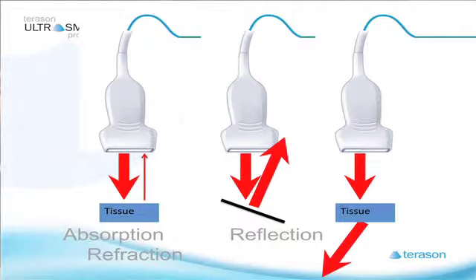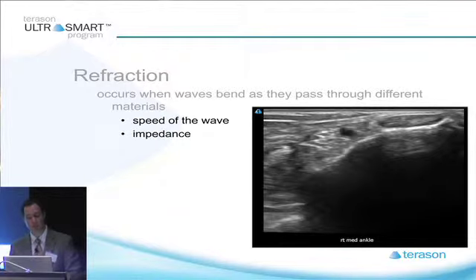For instance, if you're looking at something very dense, let's say a cross-section of a tendon, which is what we're looking at on this side of the screen. Forget about what tendon it is, because we'll get to that later. But what you see here is a very dense tendon, and if you can make out just a little bit on the edge of this tendon, you almost get this little curved shadow which comes down. You can kind of see it over here too. Here's another tendon. Here's a curved shadow which comes down like this.